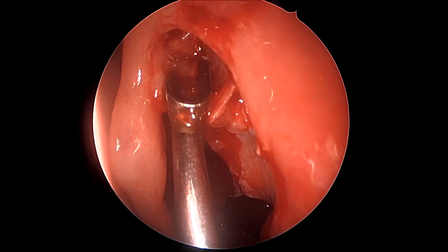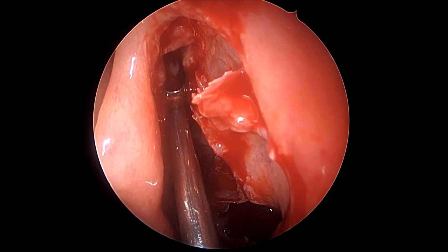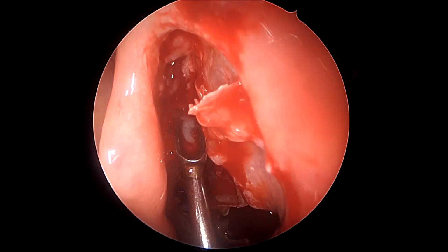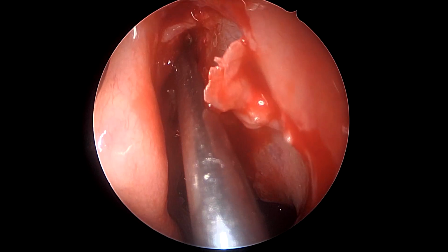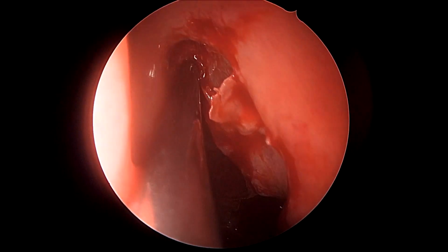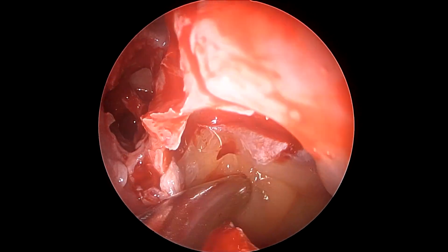As we do so, we keep going inside the frontal recess, trying to back fracture, and the technique of back fracturing actually is quite safe because the chances for any skull base penetration or trauma are substantially less unless we do very jerky movements. And as we see, gradually the recess is being opened using, at present, only a blunt frontal sinus curette.